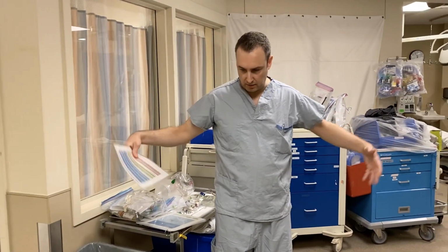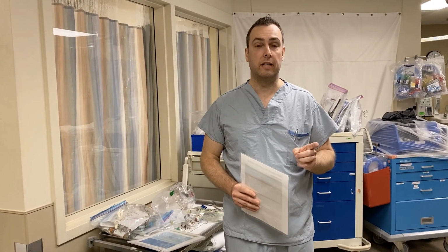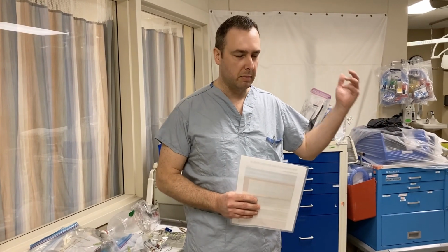You'll notice today that we're all in a mix of scrubs and street clothes. We're only going to don PPE on one individual today, and that's very much in keeping with trying to be stewards and stewardesses of PPE use, and we don't want to overuse. So for today's video, Lacey, our primary intubator, will be in PPE, but the rest of us will just stay in scrubs and or street clothes. Secondly, we're not going to use N95 masks in this video. Again, we're trying to preserve PPE, so we'll use a surgical mask instead.